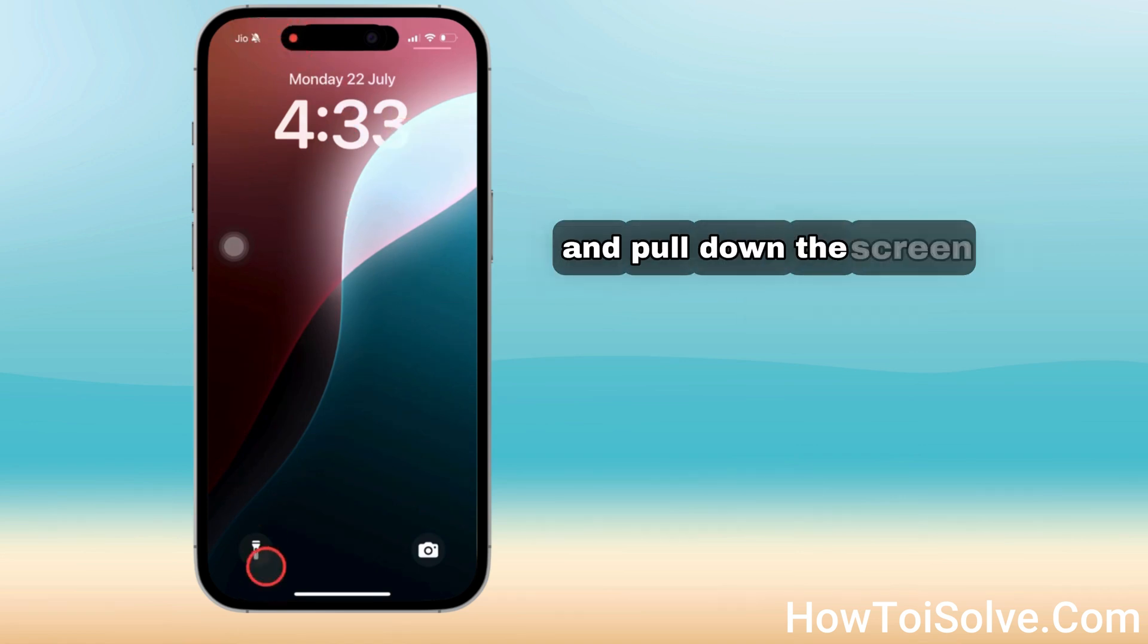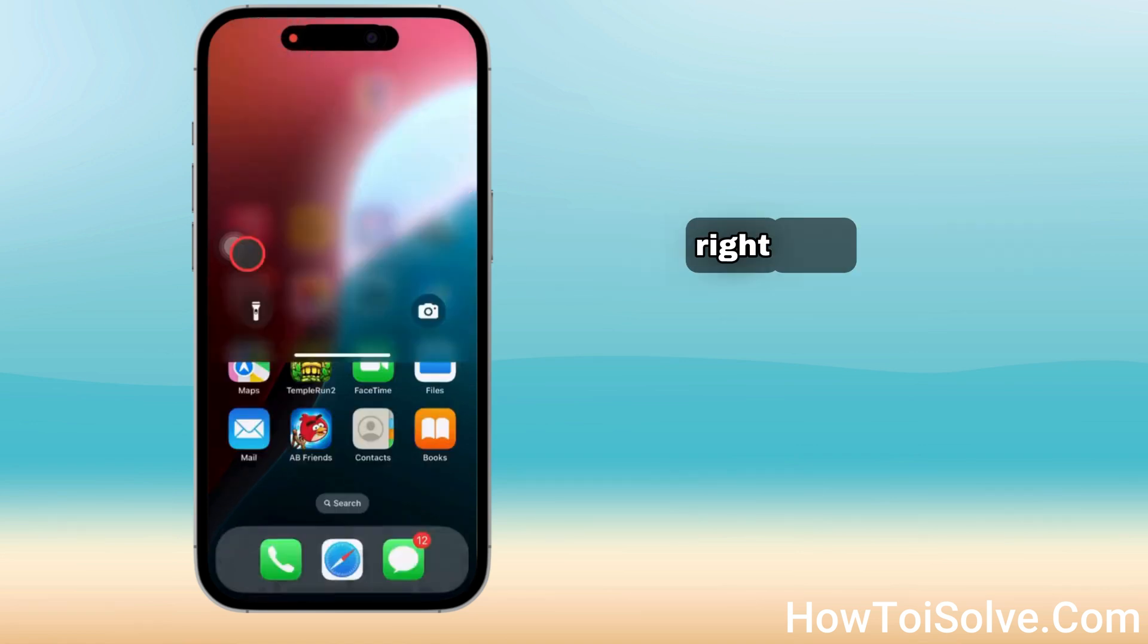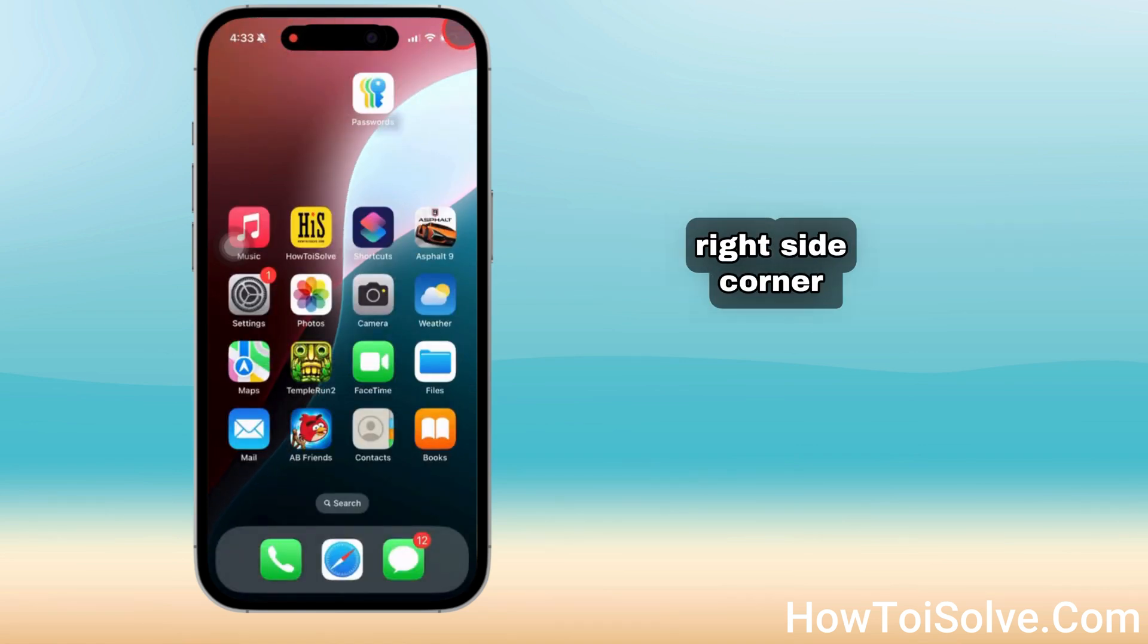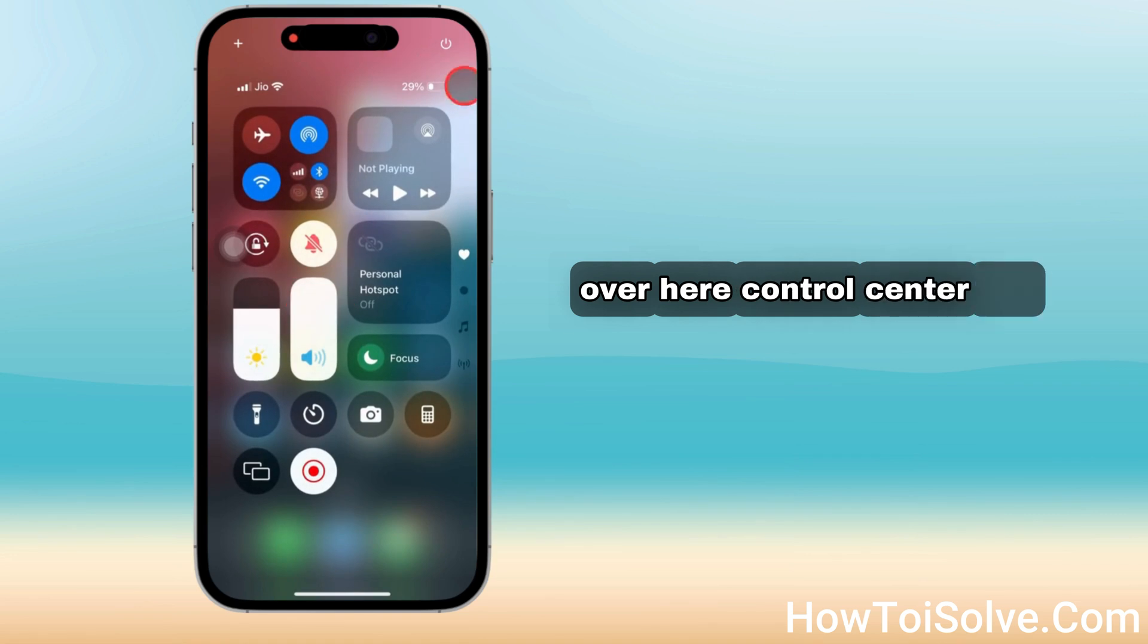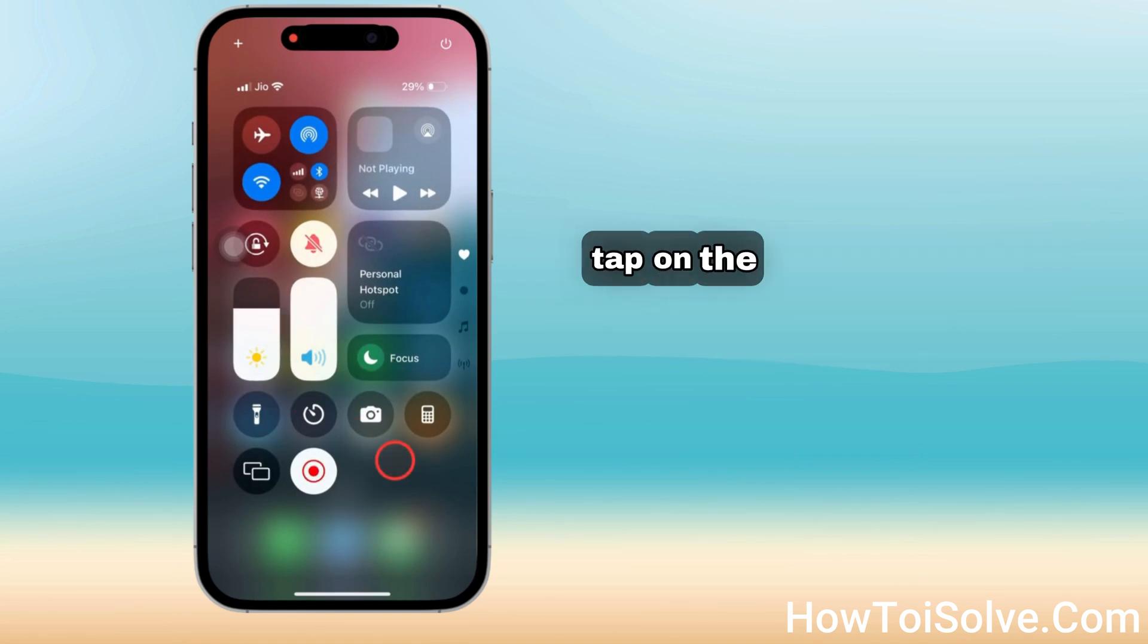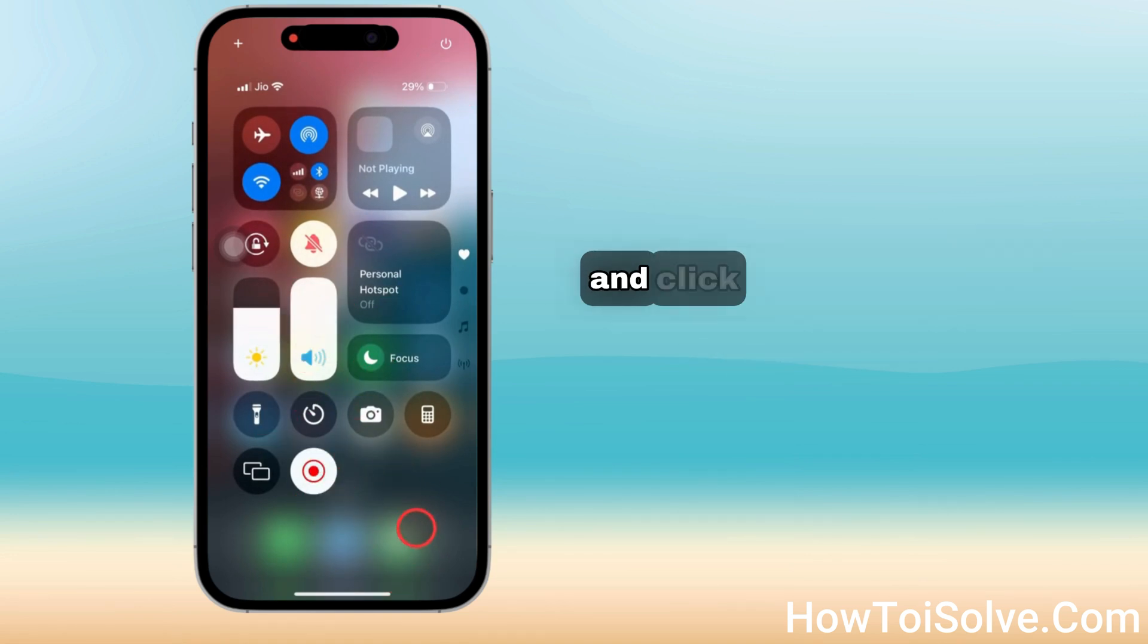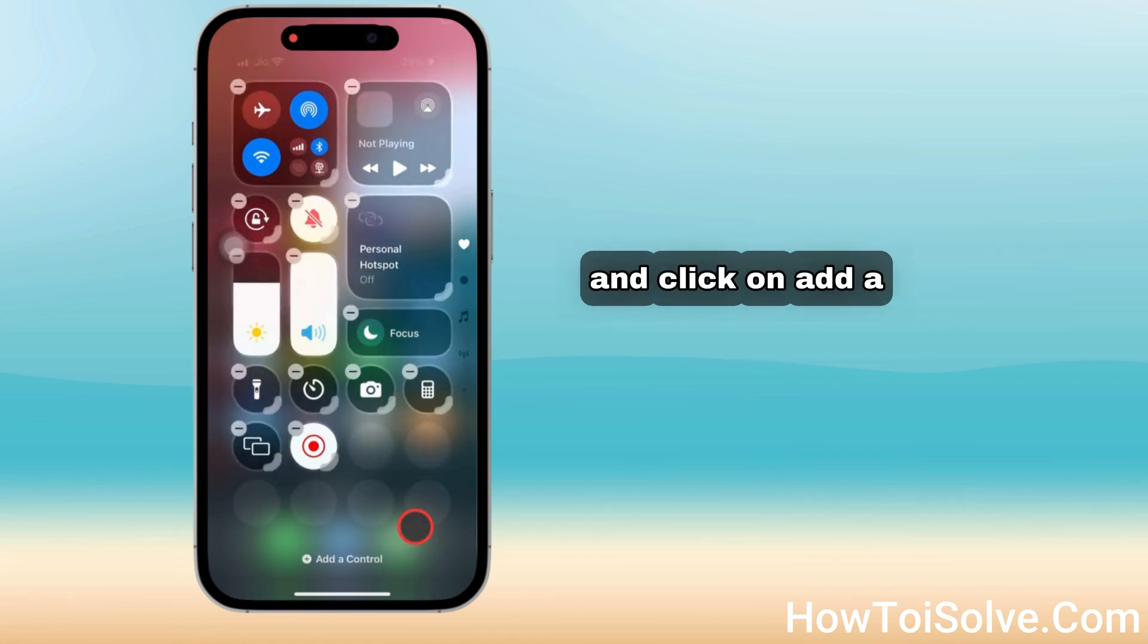Unlock your iPhone and pull down the screen from the top right side corner. The Control Center will appear. Now tap on the empty space to enter edit mode and click on add a control.